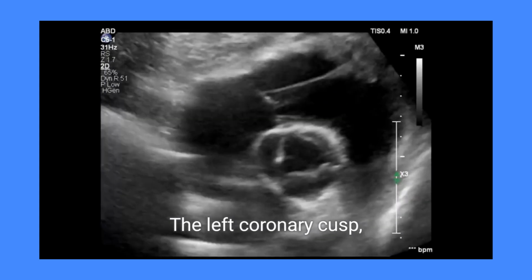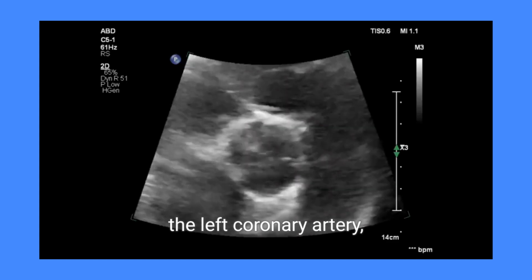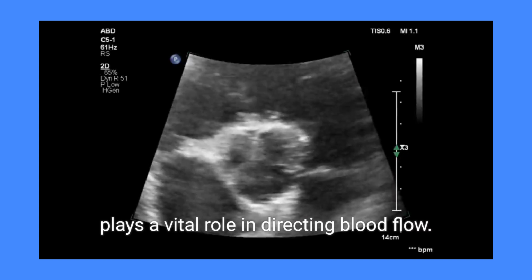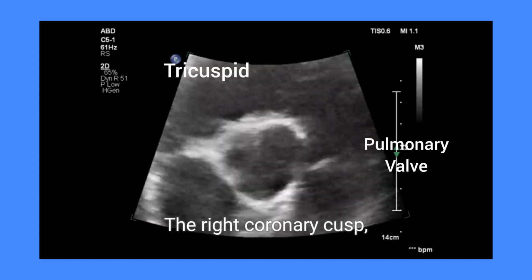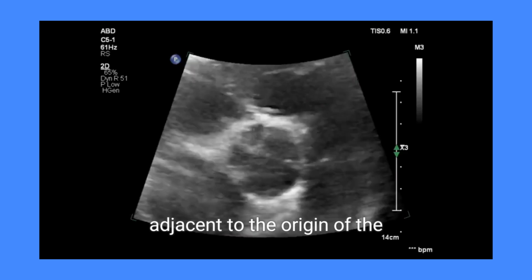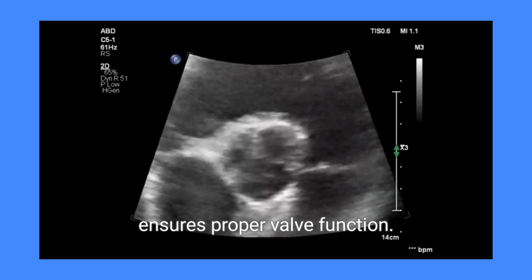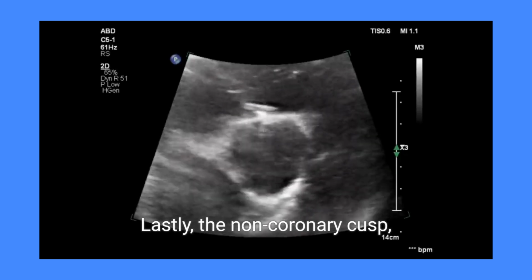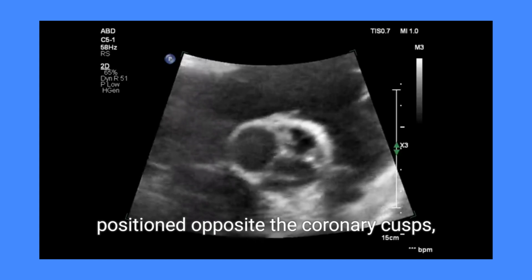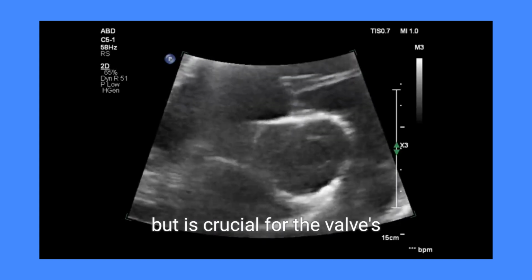The left coronary cusp, located near the origin of the left coronary artery, plays a vital role in directing blood flow. The right coronary cusp, adjacent to the origin of the right coronary artery, ensures proper valve function. Lastly, the non-coronary cusp, positioned opposite the coronary cusps, doesn't have an associated coronary artery, but is crucial for the valve's structural integrity.